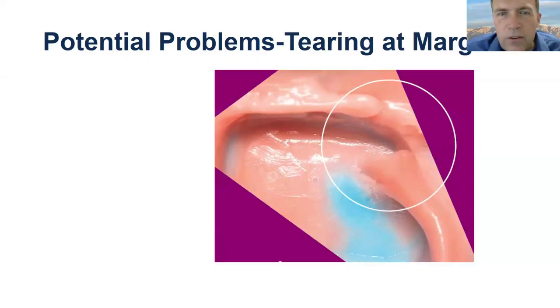If a piece of cord stays attached to the impression, the question says here, if a piece of cord stays attached within the impression, do you recommend leaving it for evaluation and removal by the lab? I do. I like being able to do that. We do it quite a bit, and it lets us see.